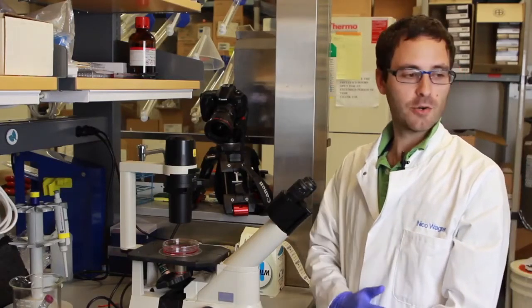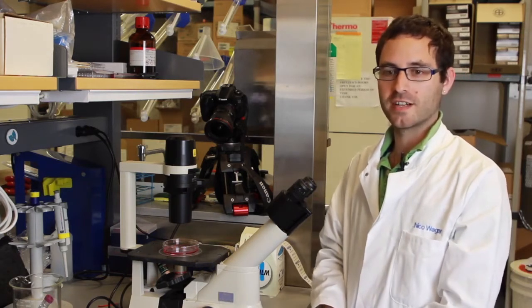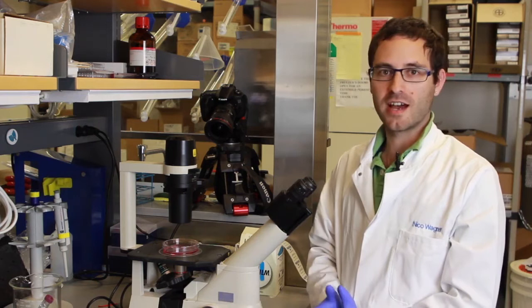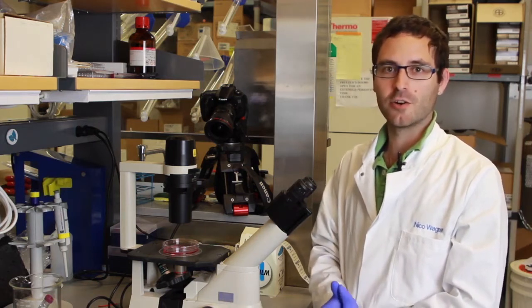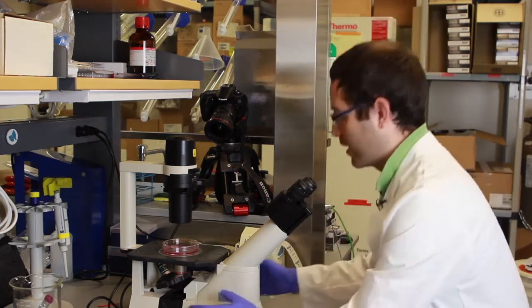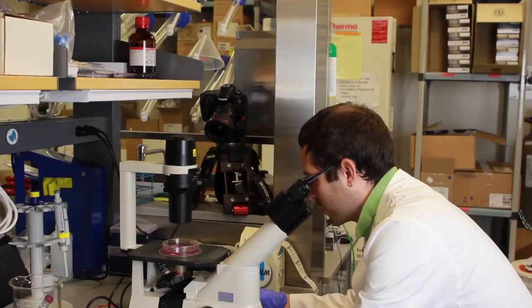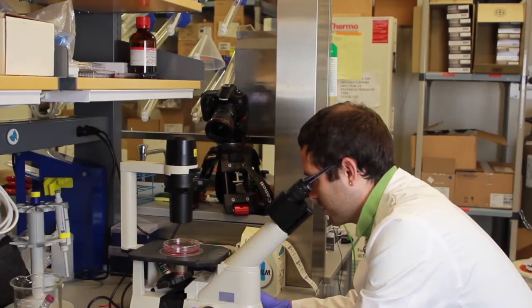Before I pass the cells and go into the hood, I like to take a peek at the cells under a microscope first. That'll tell me if they're still alive and doing well, and it'll tell me how confluent the cells are. I'll take a peek at these and these cells appear to be about 95% confluent, which is a good time to split them.